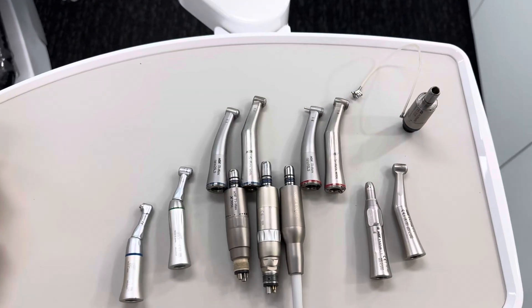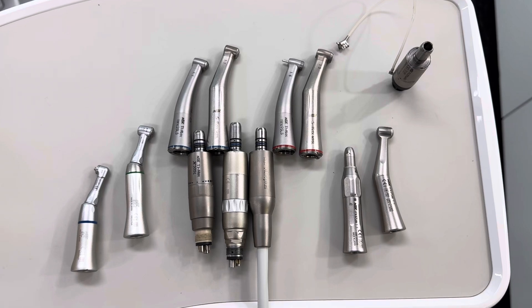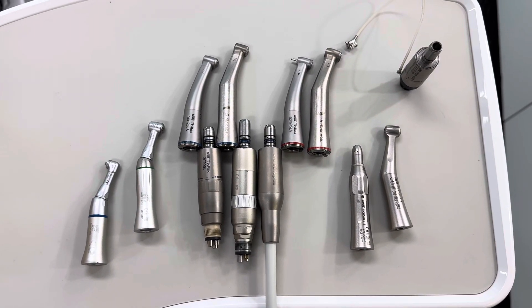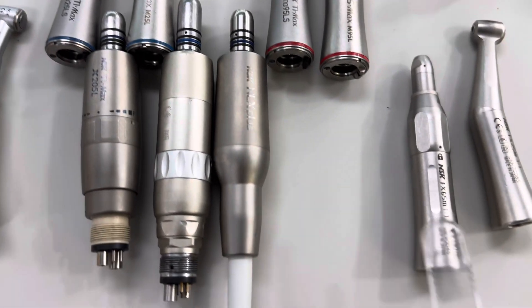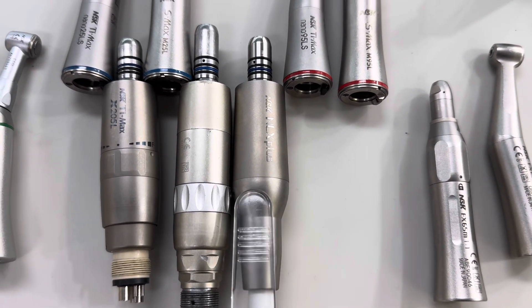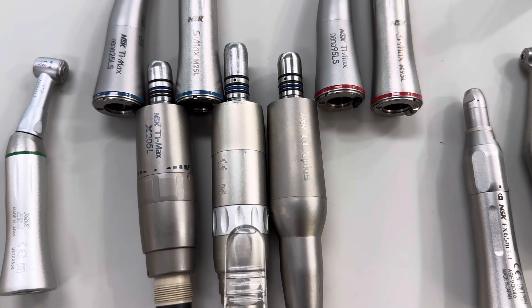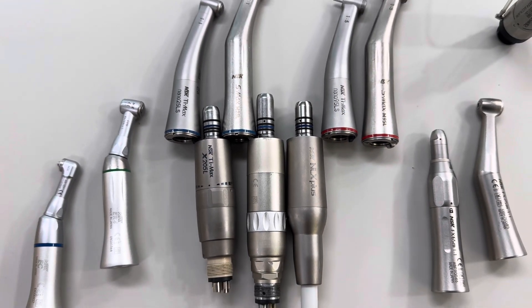Hi, it's Steve from Leading Dental. We're going to do a really quick 101 lesson on the difference between some of the E-type low-speed or slow-speed motors and the handpieces that fit on them. What we've got here is a top-of-the-line electric from NSK, an older style air motor with an old bulb style motor, and then one of the newer style LED air motors.